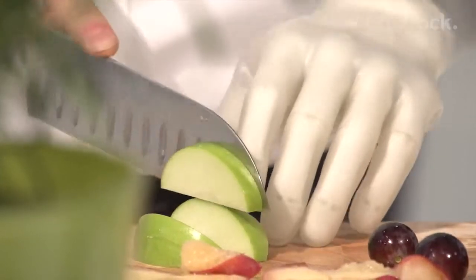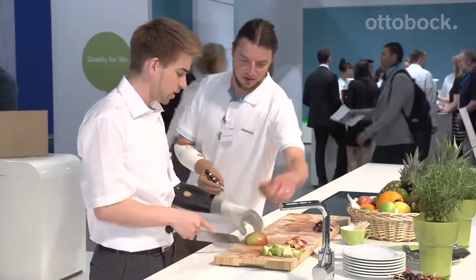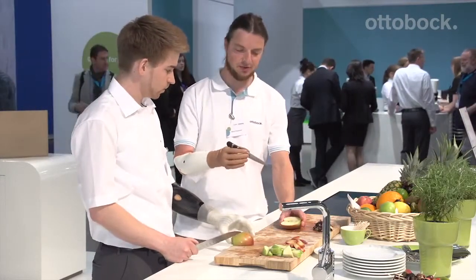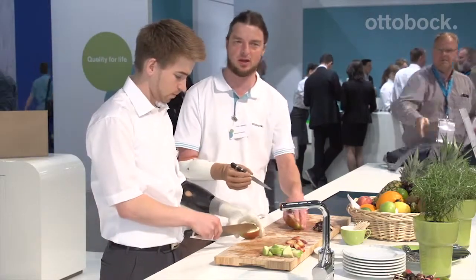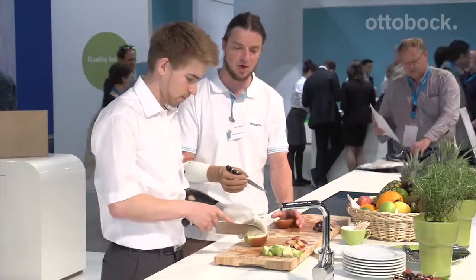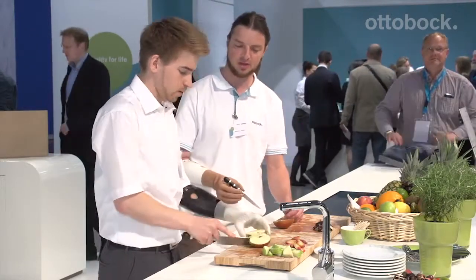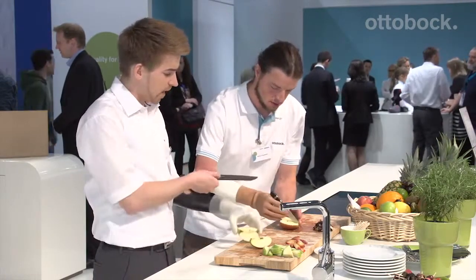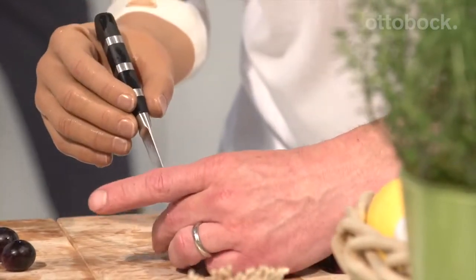So Markus, when you're cutting fruit, for example, how do you go about it? I use the three-point grip, the power grip, which has seven kilos of gripping power behind it. Because of my short limb, that feels secure to me when I'm holding the knife — not like you with that apple. But you grab the apple with the prosthesis. I can actually hold the apple firmly with my hand. Markus is cutting away there, but there are indeed different ways people go about this using their prosthesis.